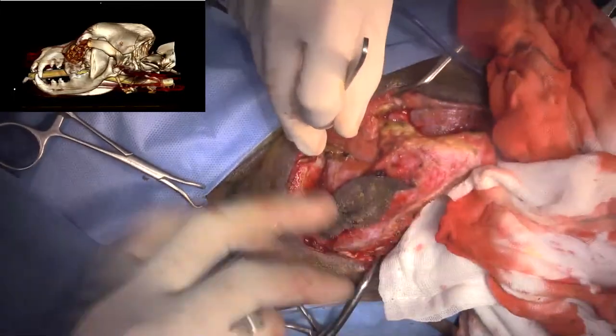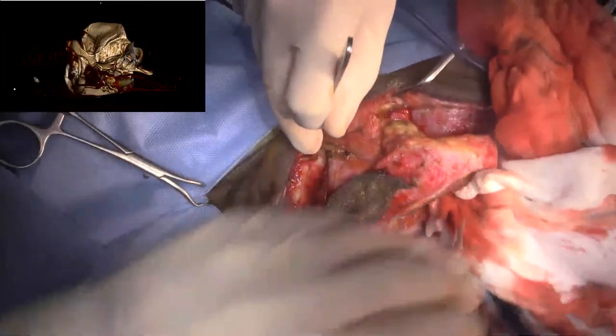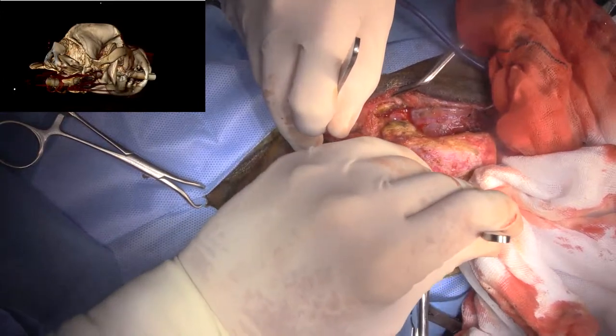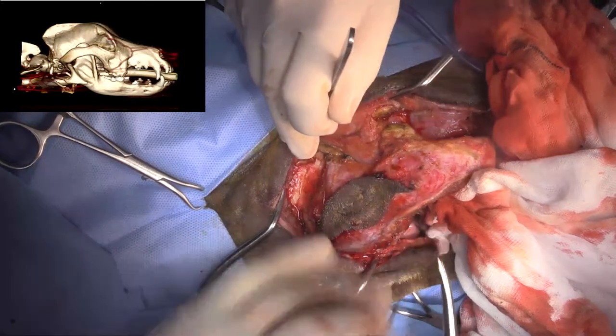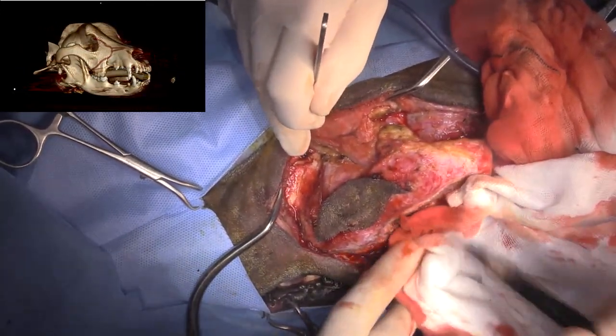Okay, so I'll just pack this underneath here. And then eventually we're going to have to get to the point that we don't have any choice but to start cutting the bone of the maxilla and the nasal bone, which is a little bit scary because you're cutting blind. And so I like to expose as much as I can.